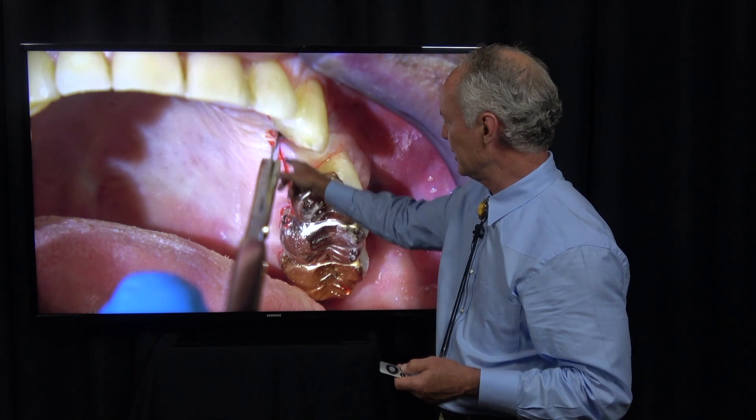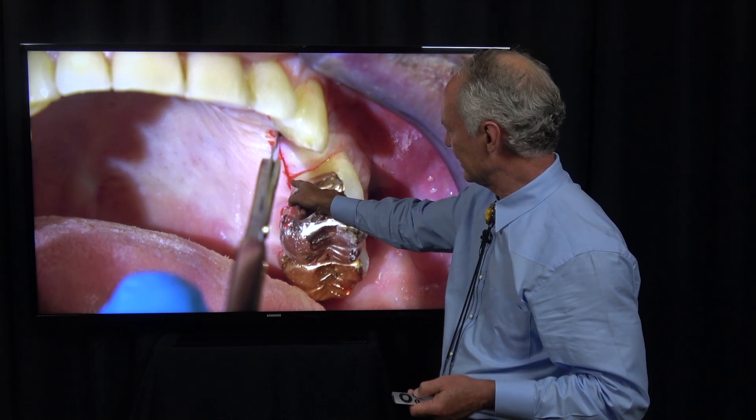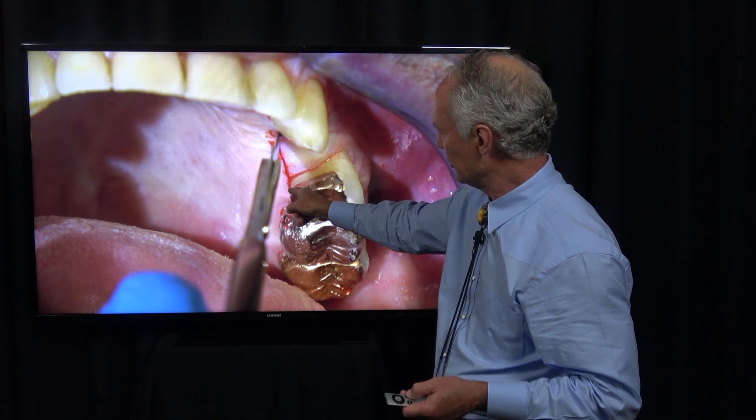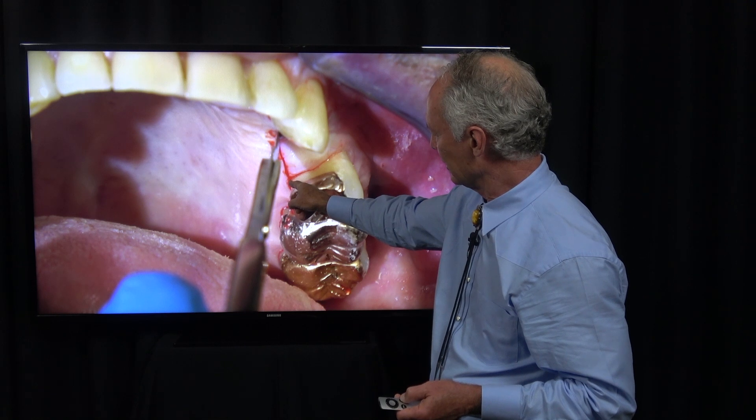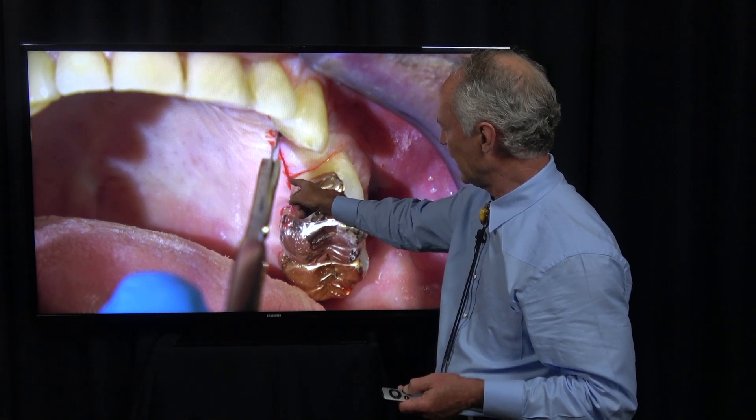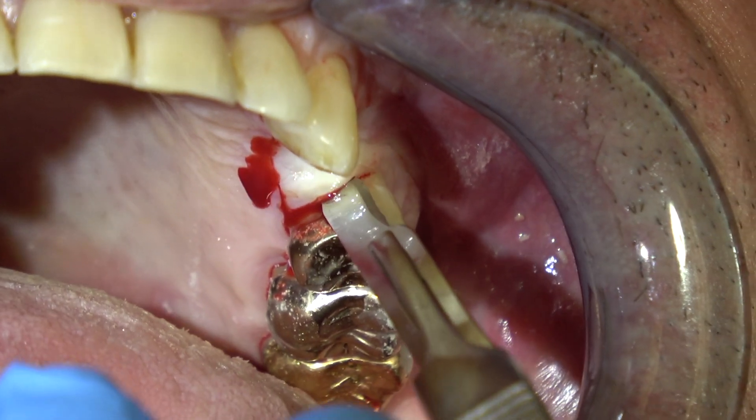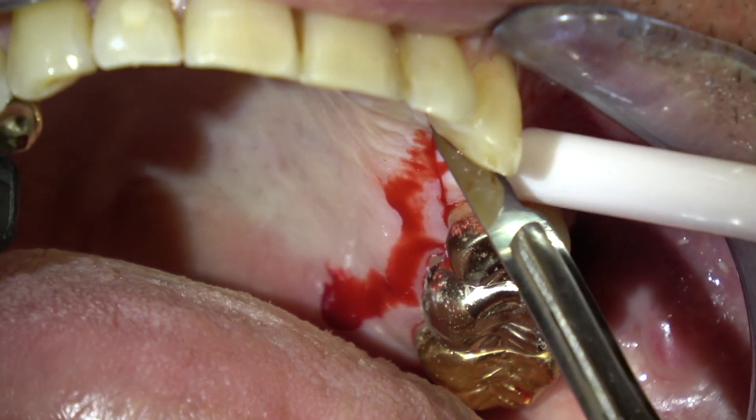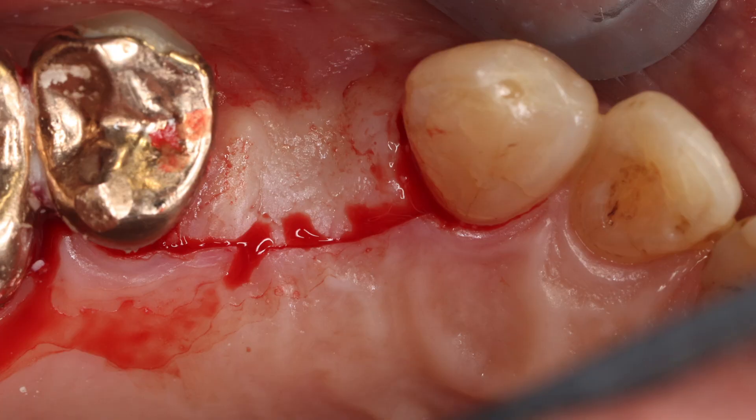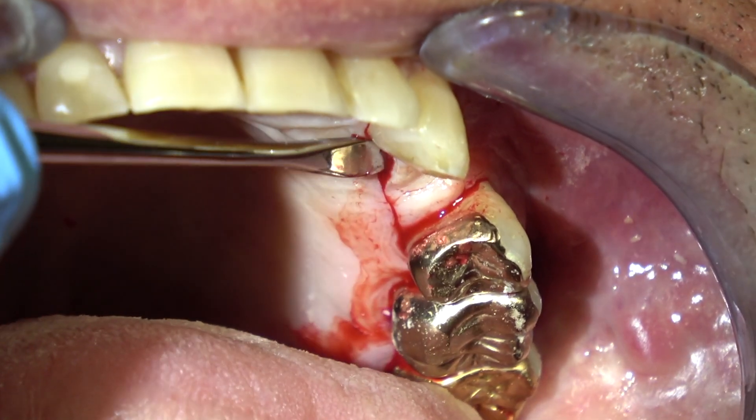Make your releasing incision on the palatal at the mesial palatal line angle. Not way out here—make it from line angle to line angle of the tooth to expose the grafted area. Then release on the mesial and distal of the flap and reflect it to the facial.